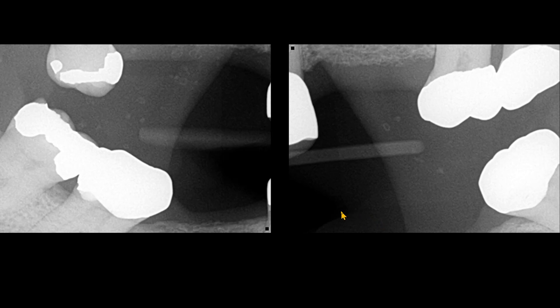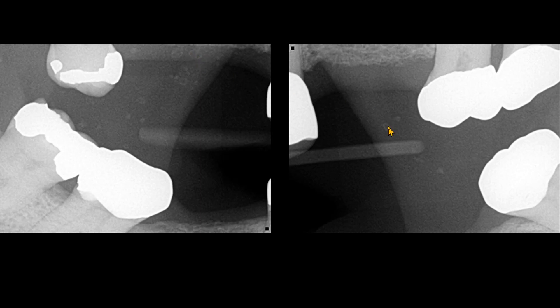These are other examples of osteoma cutis — same patient, right and left cheek. You can appreciate that these are donut-shaped radiopacities with a well-defined outer margin and less dense inner area. And this one has more of a donut shape.